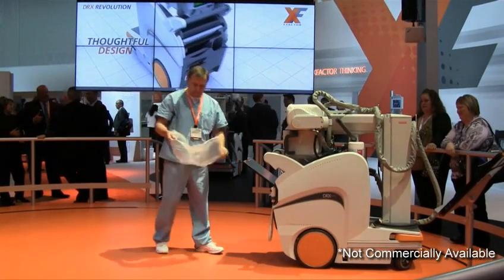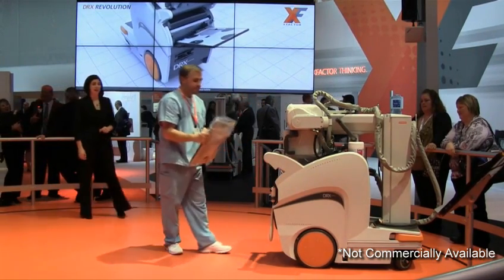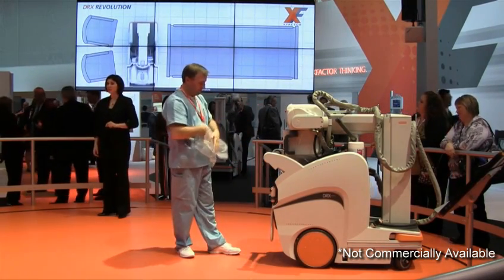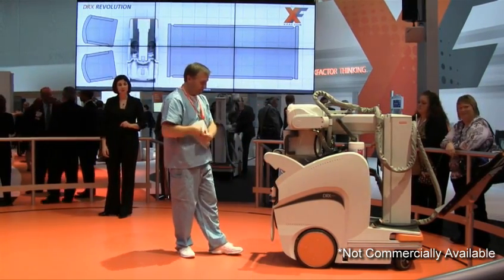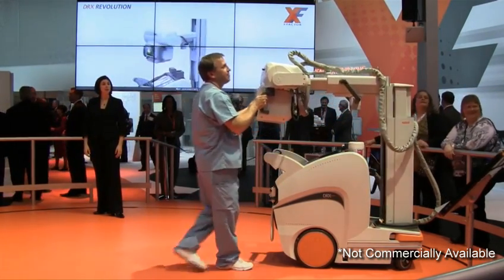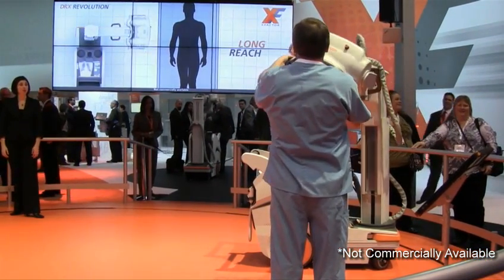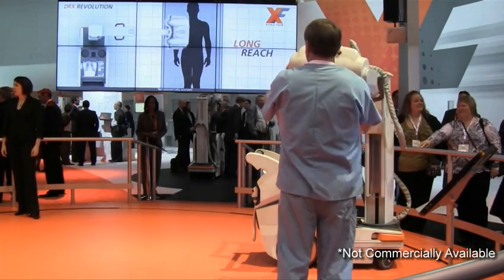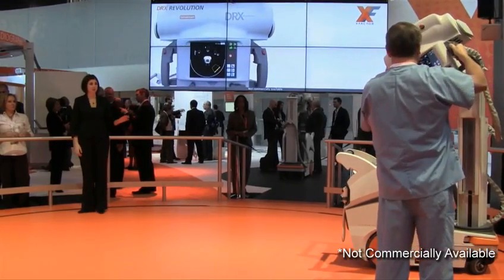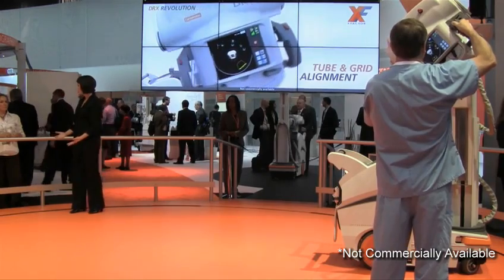The DRX Revolution will feature a ground-up design attending to every detail, like this holder intended to provide an extra pair of hands for bagging the DRX detector. A crowded ICU room won't be a challenge — the column will be designed to extend to a working height with a long tube head reach for quick positioning even in the most crowded rooms. We plan to enable adjustment of tube head positions with an all-release button, the same as in a radiology room. We are developing innovative software for the DRX Revolution aimed at precise tube and grid alignment, which encourages the use of grids.